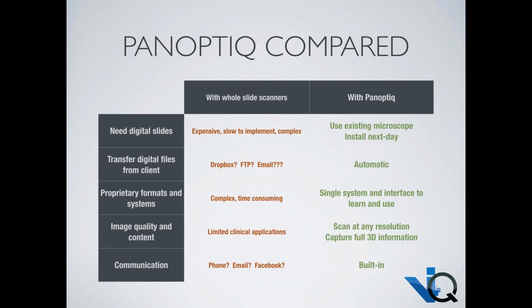They are obviously a lot smaller than a whole slide scanned image because you can only scan the regions of interest, the clinical regions of interest at a higher magnification, while the rest of the slide is done at 4 times or 10 times magnification, just so you can see the overall morphology of the sample at a low magnification, which is all that might be clinically relevant in that case.